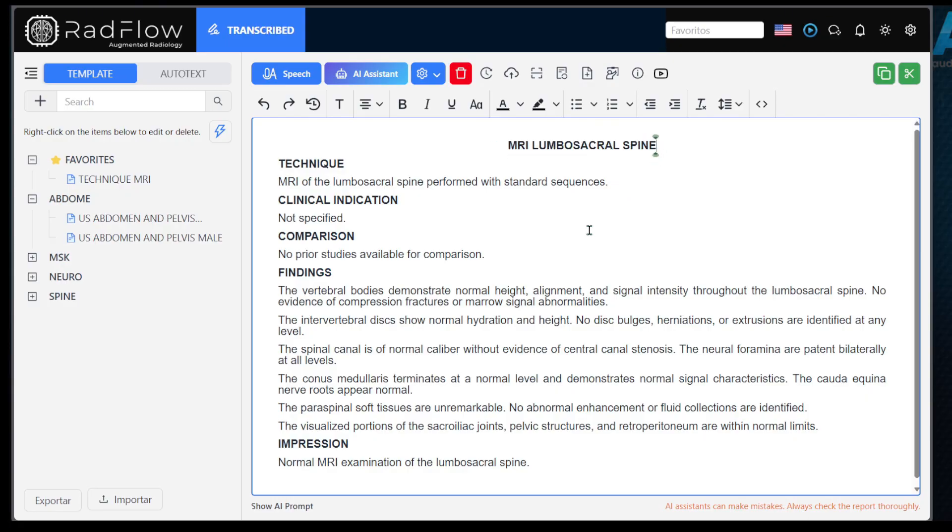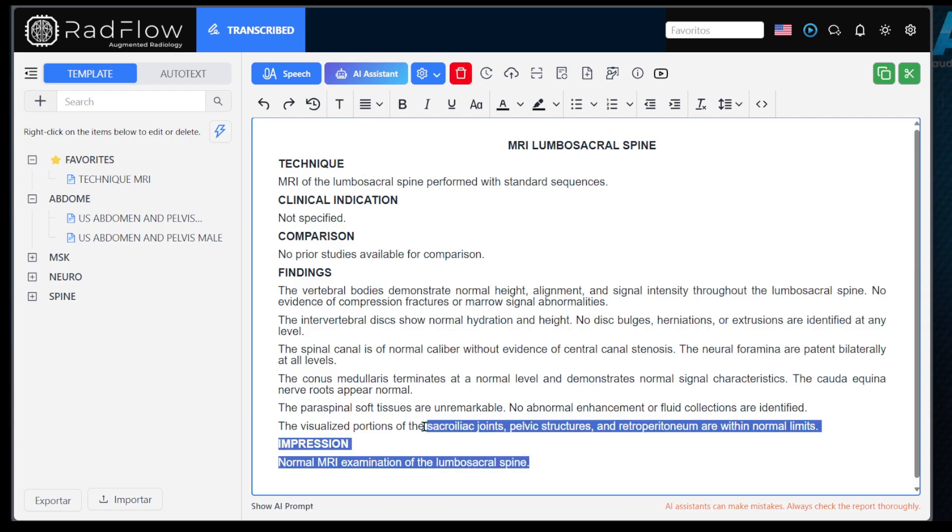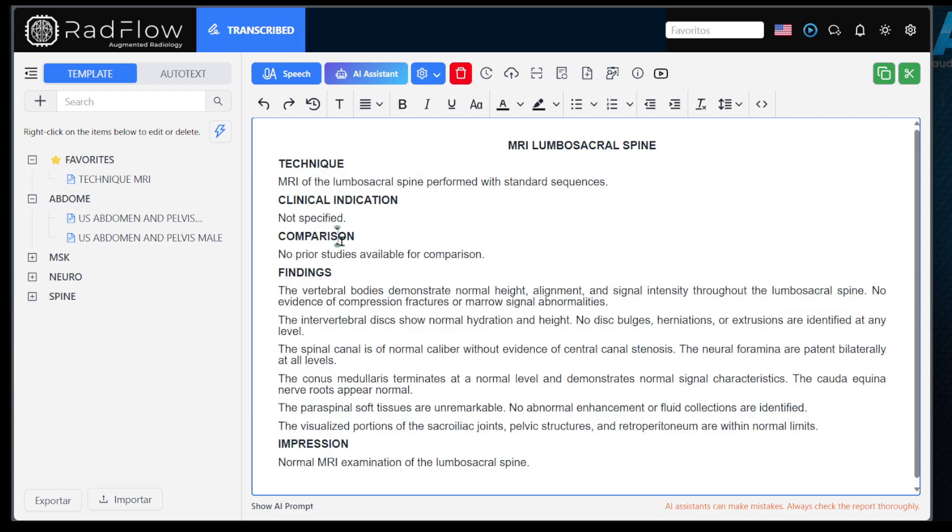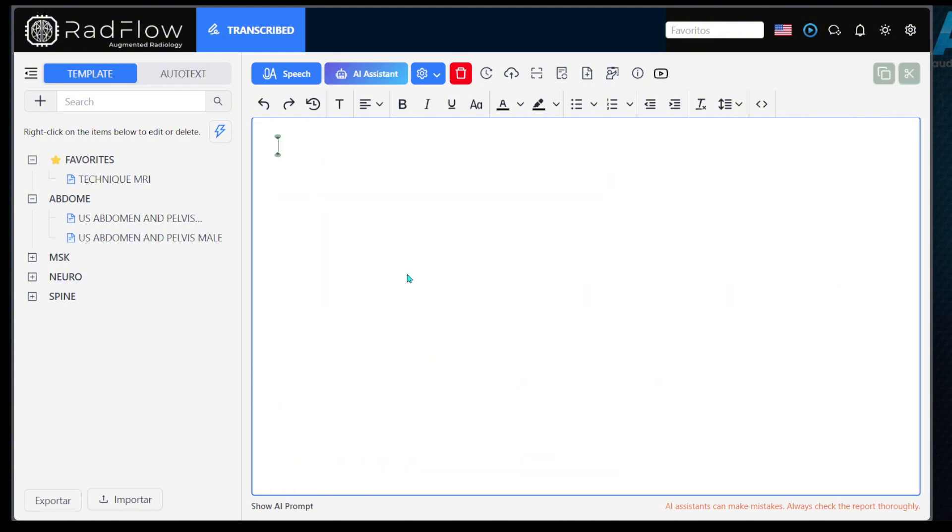When you start recording, you can dictate the entire report freely. There is no need to pause and resume frequently. Even if someone interrupts you, the assistant will transcribe only the relevant content for the report you are working on. Check out this example.